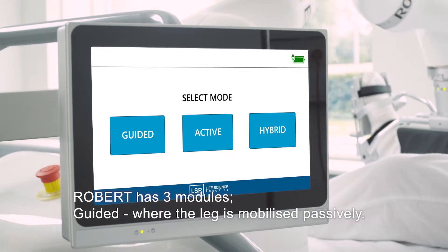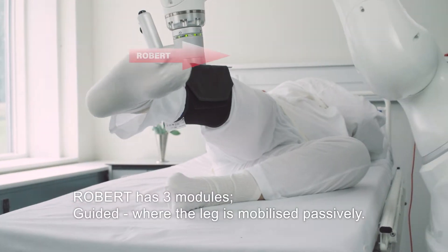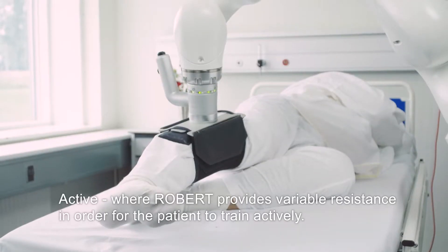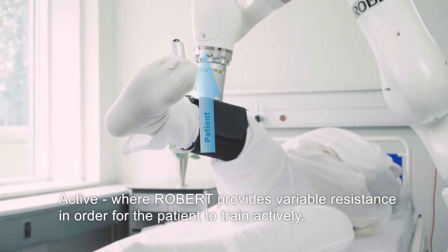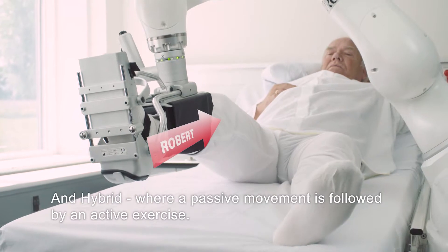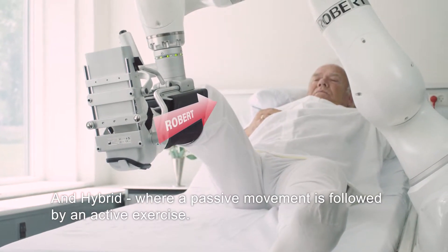Robert has three modules. Guided, where the leg is mobilized passively. Active, where Robert provides variable resistance in order for the patient to train actively. And hybrid, where a passive movement is followed by an active exercise.